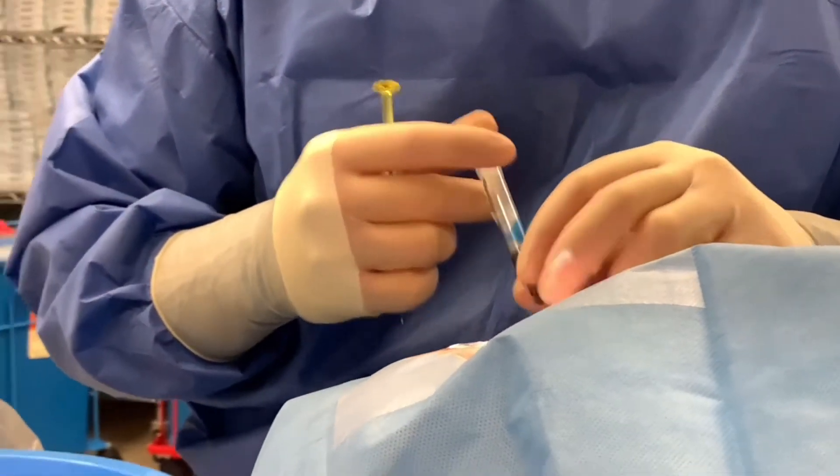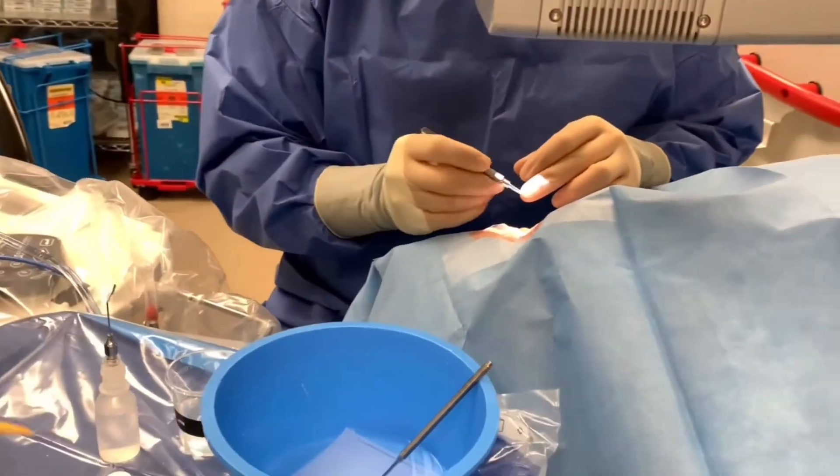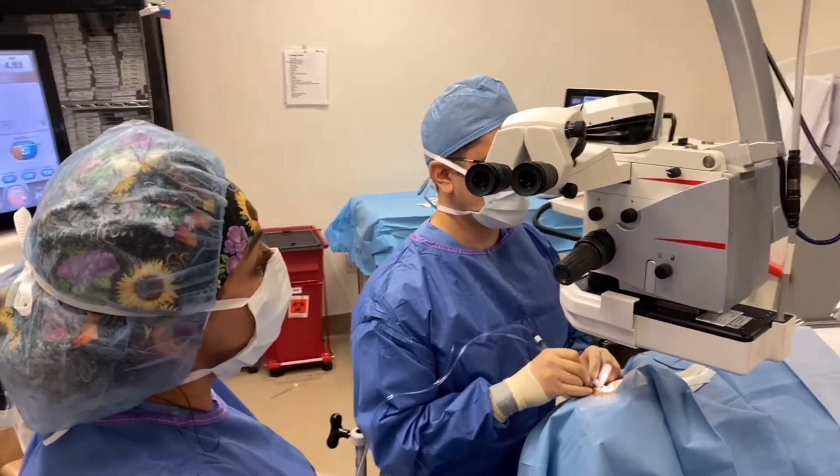So what do we do? Well, we go to surgery and we fix the problem. Historically, sutures were used to either anchor the lens implant to the iris or the inside lining of the eye onto the sclera.